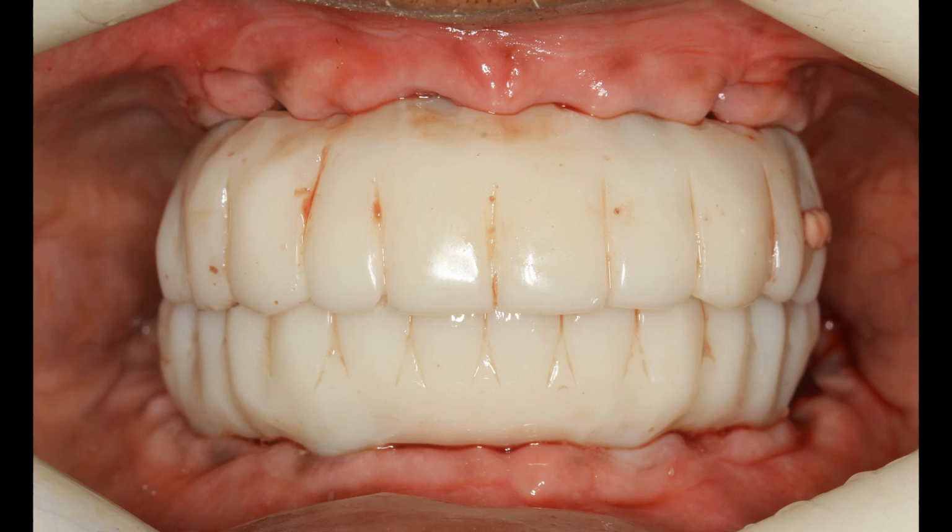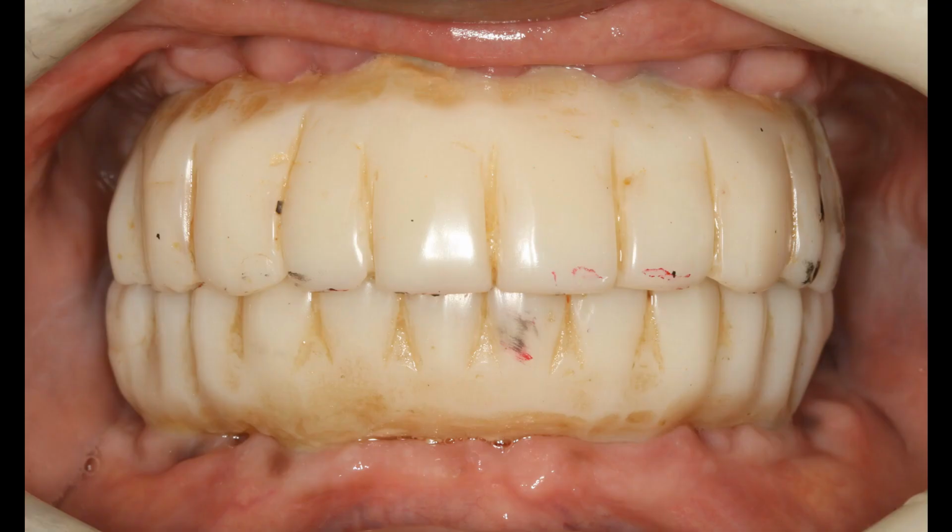And even though it doesn't look beautiful here, what I want you to notice are the gum tissues and how they meet the prosthesis. And you'll follow these along with me during the presentation to see how beautifully they heal. This is the patient's temporaries after approximately 2 months.